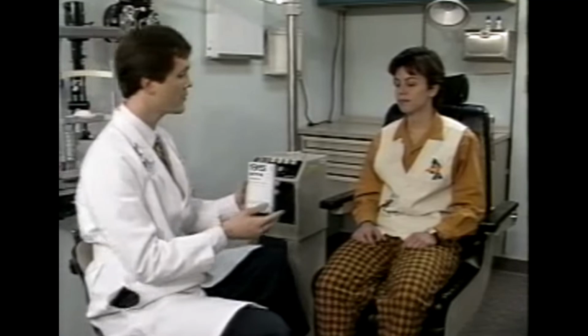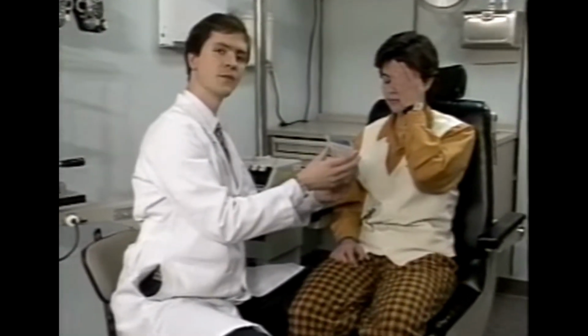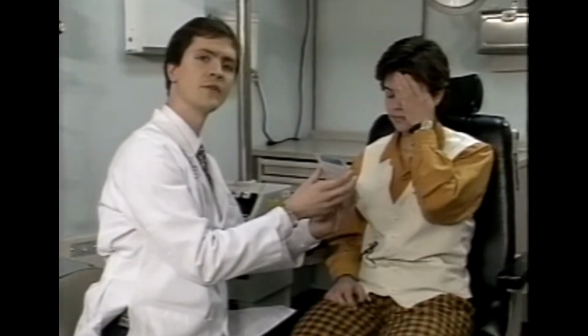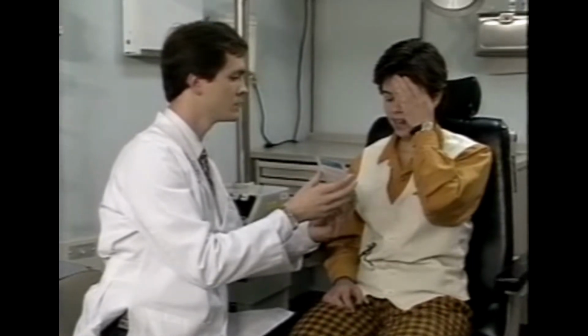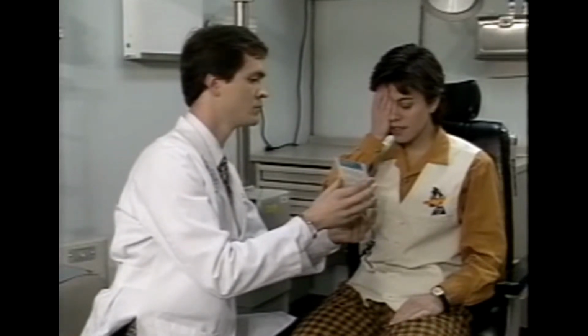To do this, use a near card such as this one. Have the patient cover one of their eyes. Hold the near card approximately 14 inches from the patient's face. Ask them to read the smallest line of numbers that they can. 428739. Have them cover their other eye and do the same. 428739. Visual acuity is recorded as 20 over blank. Perfect visual acuity is 20/20.